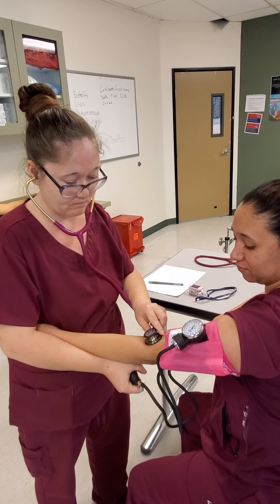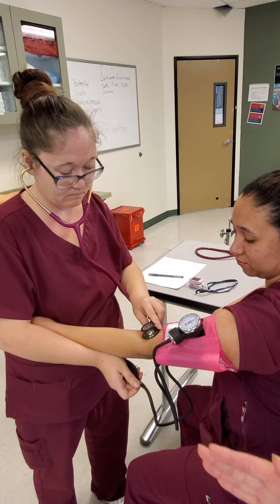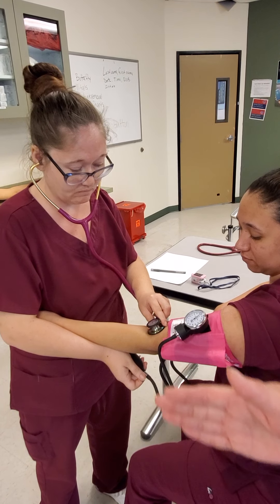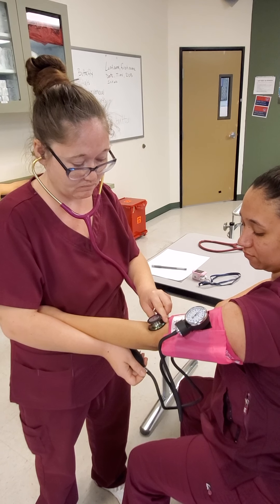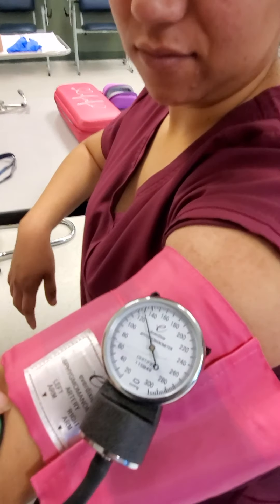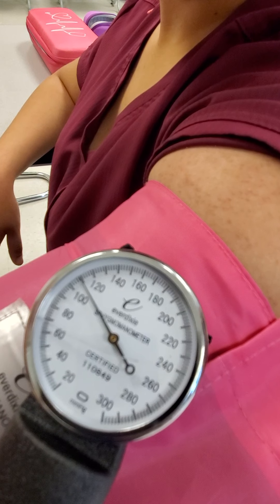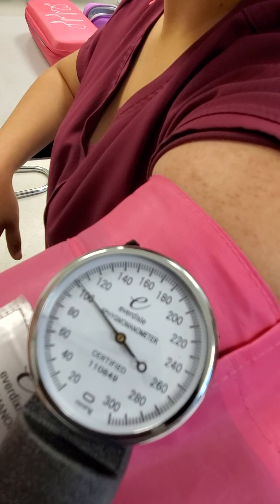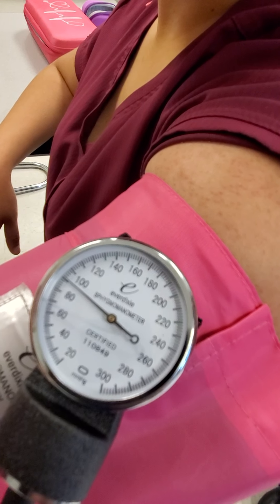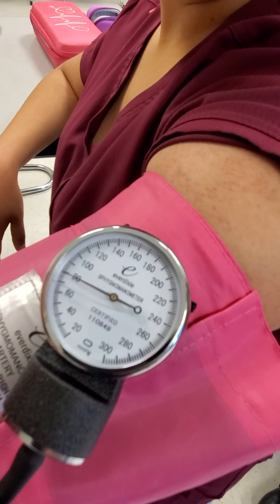She's going to pump up between 160 and 180. If the patient is known to have hypertension, we may need to pump up to 210 or 220. She's listening for the systolic sound, which I believe was right about in that 100 area. And now she's waiting for the diastolic sound.